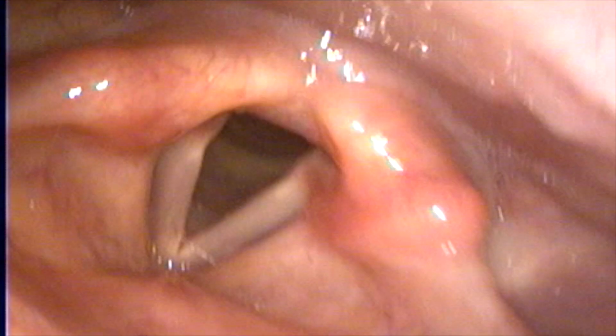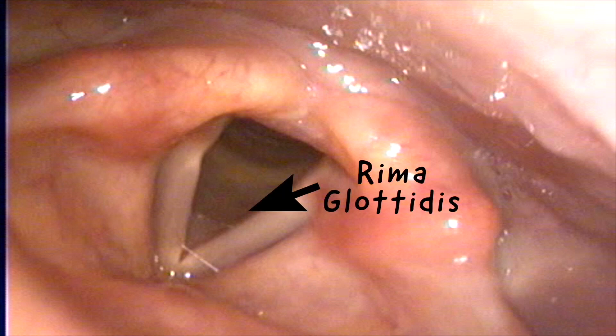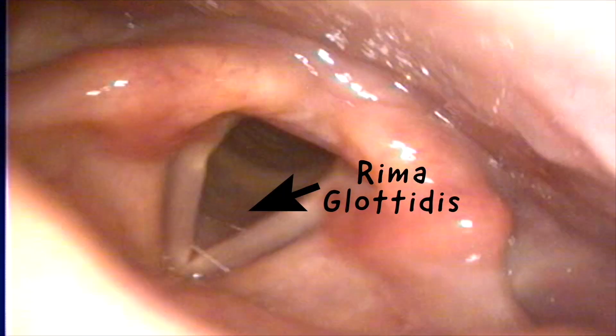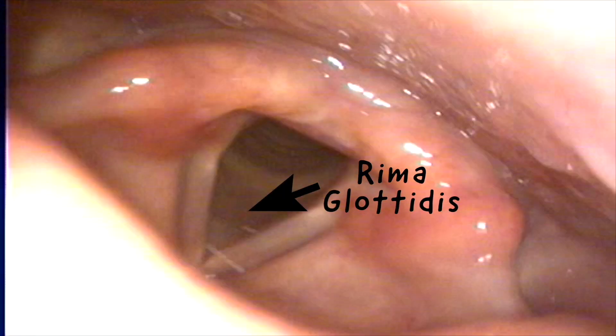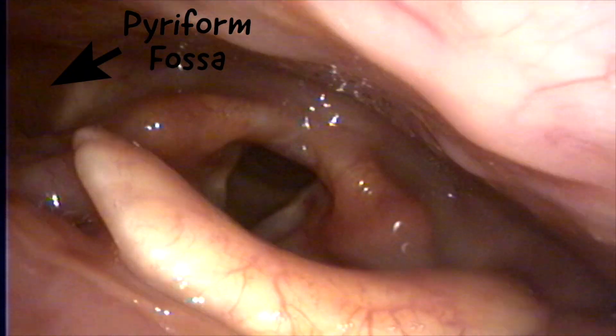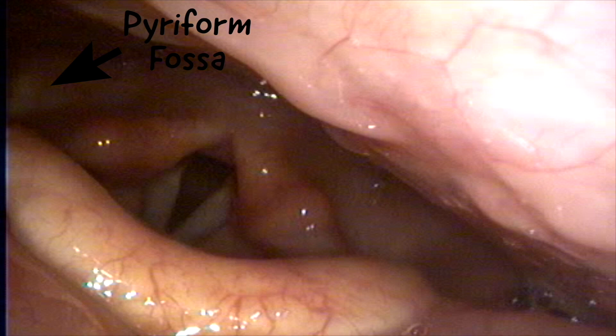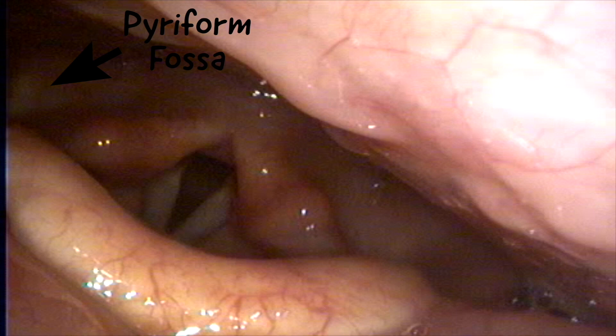We can also clearly see the rima glottidis, which is the opening between the true vocal cords and the arytenoid cartilages, as mentioned earlier. The final anatomical structure I would like to mention is the piriform fossa. There are actually two of these, one on either side of the aryepiglottic folds. They are clinically relevant as they are a common place for food to become trapped.